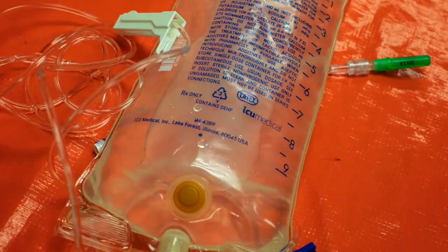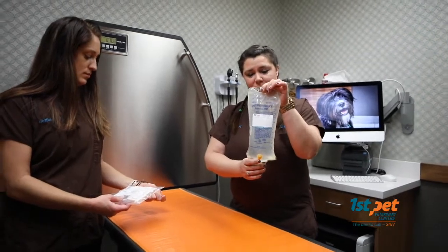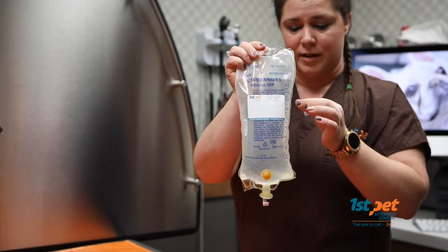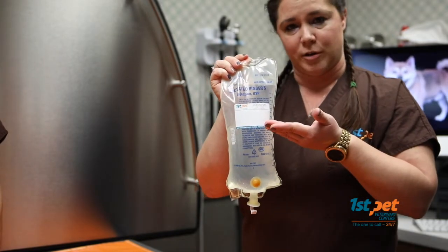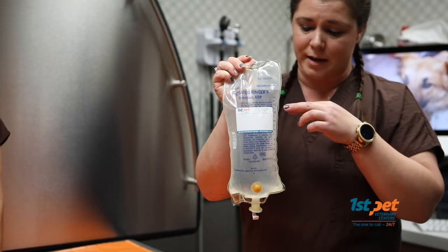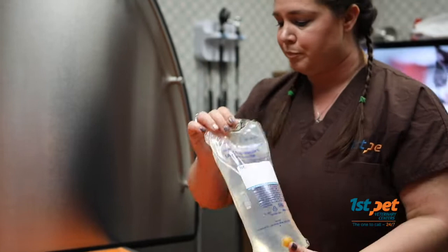and today we're going to explain to you how to set up a sub-Q fluid administration set. When you go home with fluids, you get a bag of fluids that look like this. This is 1,000 milliliters or 1 liter. And each one of the little tick marks that you see on here represent 100 mils. And you'll have your instructions, usually on your bag, for you as far as what you would administer. Most of the time we go home and we're administering at least 100 mils at a time, so you would know to go to the tick mark with the numbers.